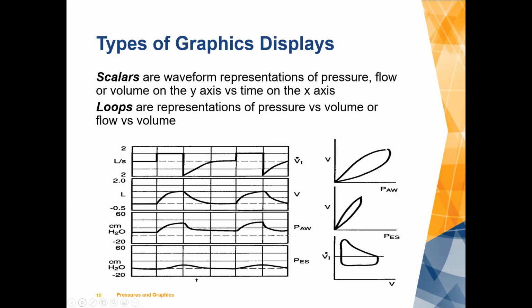The loops can also be useful, and they're representations of pressure versus volume, or parameters like flow versus volume. I have very quick examples of a scalar on the bottom left, and loops on the bottom right there. We'll take a deeper dive.